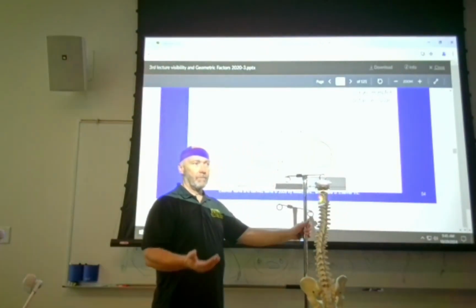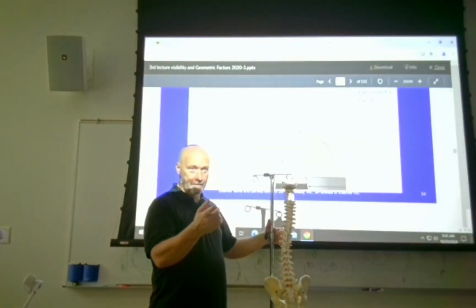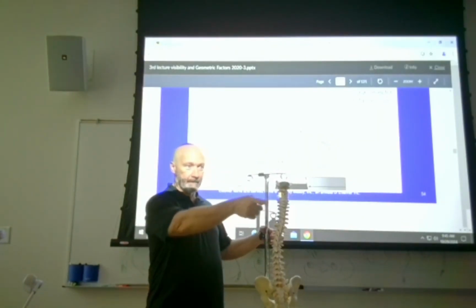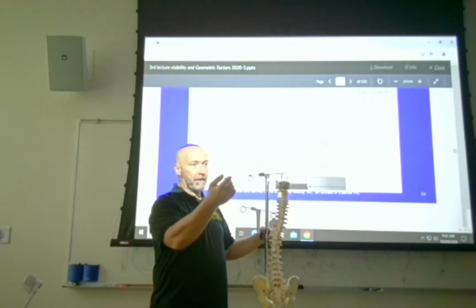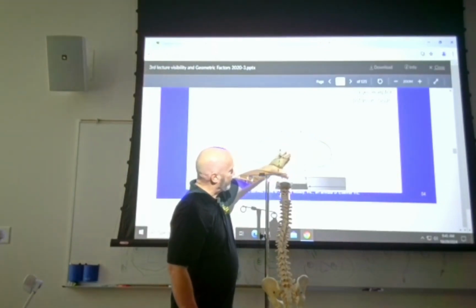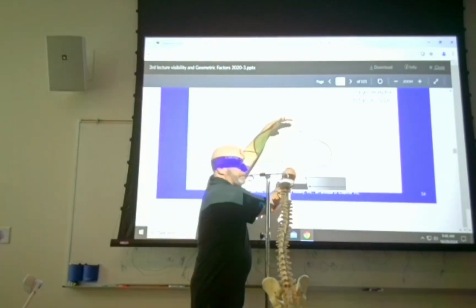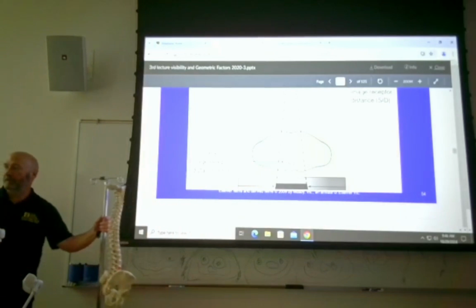So the question is, why don't we do our lumbar spines PA? What's that? I said a lot of the patients handle that. That's number one. Ever had a backache? Yeah, you can't get the patient into the position, one, because their back hurts, and laying on their stomach isn't going to be an option. But the other one is your OID, giving us some magnification, is here for the AP, as opposed to it would be this much for PA. Right? So we lose sharpness of recorded detail.